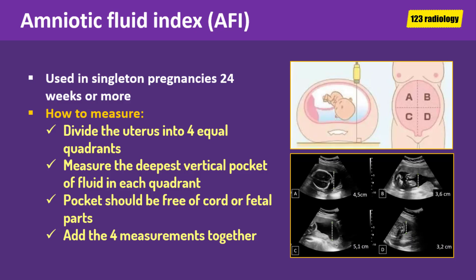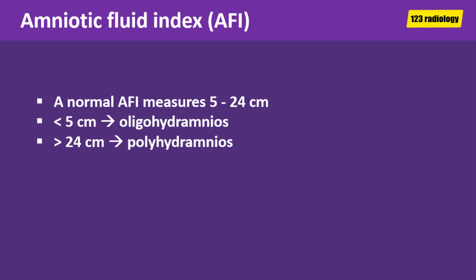Amniotic fluid index is used in singleton pregnancies at 24 weeks of gestation or more. In this method, the uterus is divided into 4 equal quadrants, measuring the deepest vertical pocket of fluid in each quadrant using the same technique as for maximum vertical pocket, then adding the 4 measurements together to give the amniotic fluid index value in centimeters. A normal amniotic fluid index measures between 5 to 24 centimeters. Less than 5 centimeters is oligohydramnios and more than 24 centimeters is polyhydramnios.